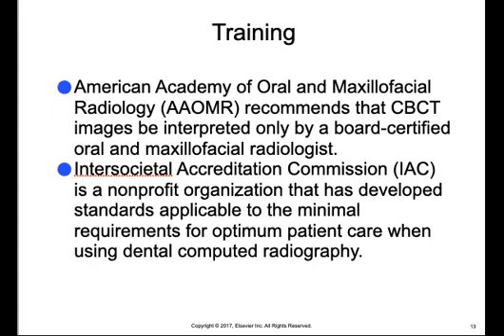The American Academy of Oral and Maxillofacial Radiology recommends that CBCT images be interpreted only by a board-certified oral and maxillofacial radiologist or by a dentist that has adequate training and or experience.